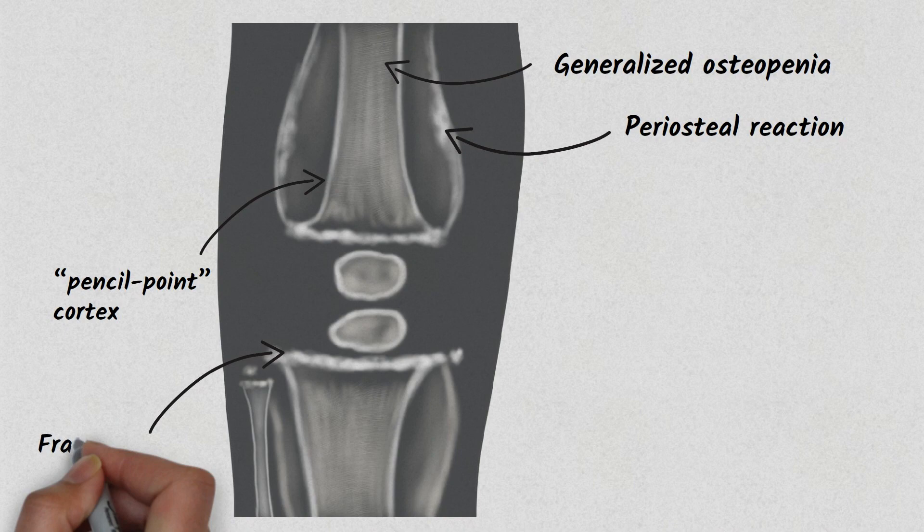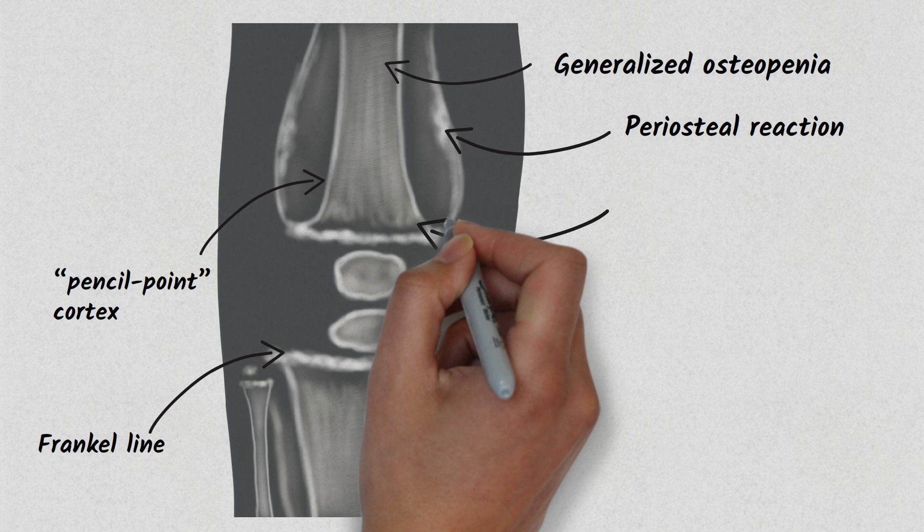Just underlying the Frankel line, you can appreciate a radiolucent band-like area. This metaphyseal band is called Trümmerfeld zone.